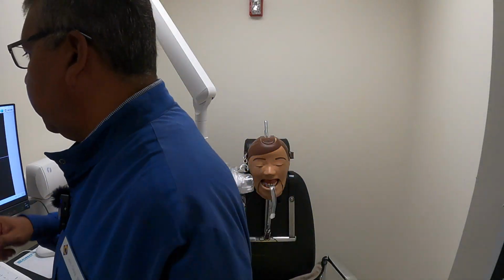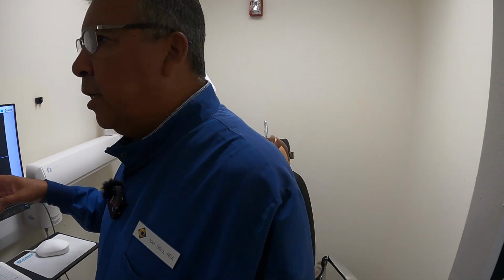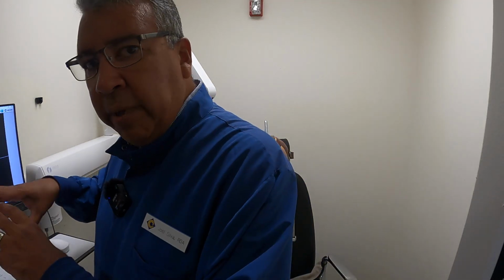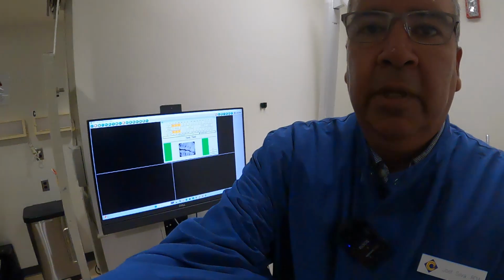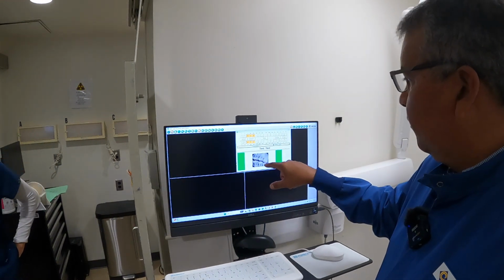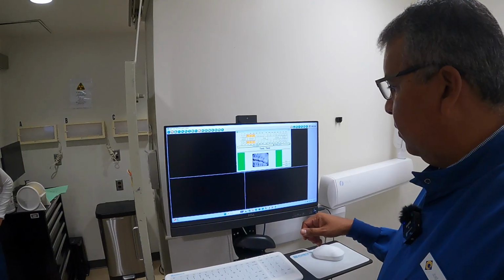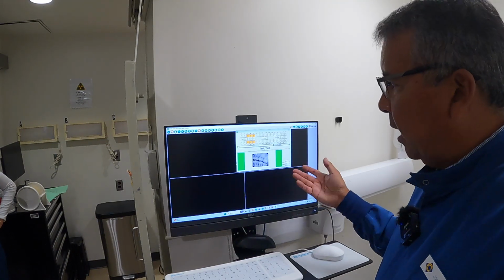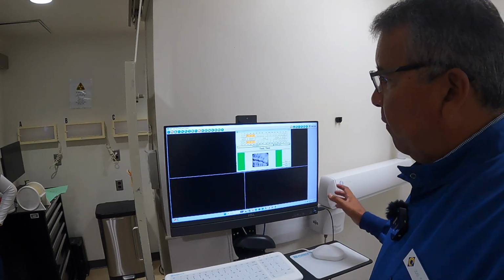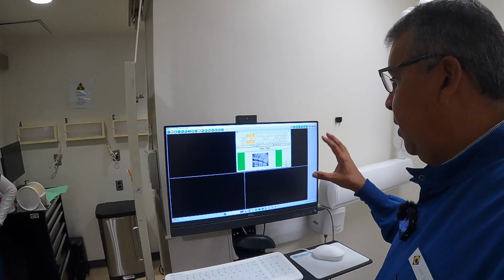And it's actually upside down, you know. I'm not worried about that, because when you're done, it'll actually orient itself to the way it's supposed to look. Okay, so it showed up on screen. It's upside down. It's just the way that this machine kind of does it. So this is Dexis. I don't know if all the programs out there do this, but I know that Dexis does. But I'm going to stop this for now.